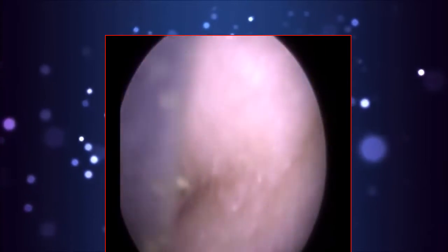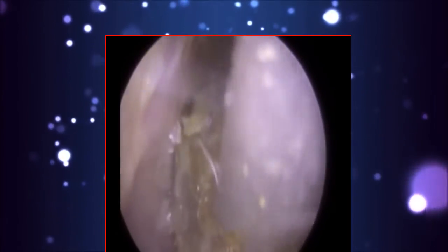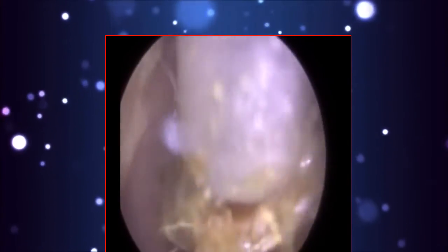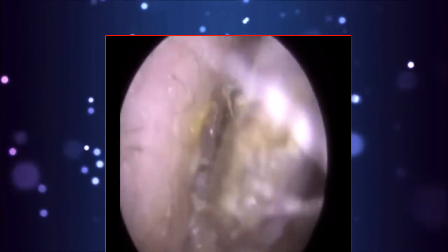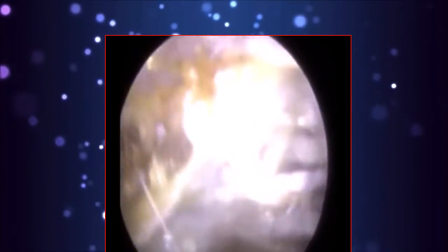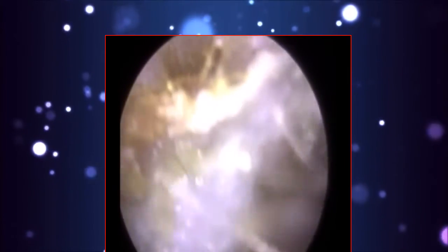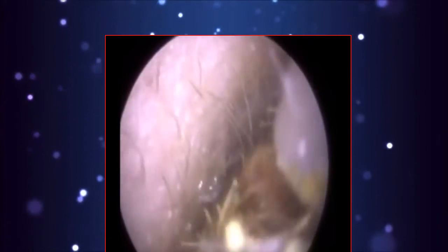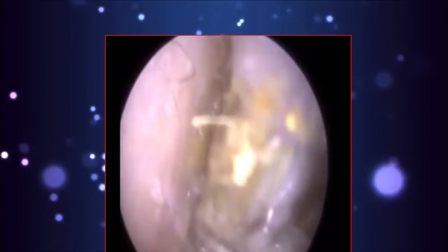So yeah, the eardrum's nice, visible, healthy. This is the patient's, same patient, but just the right ear. You can see a plug of wax here. It's not as impacted as the left side, so the patient did attend, he wasn't aware that his right ear was even blocked, given his left ear was so bad. So it was only until I removed the left plug of wax, he suddenly noticed that his right ear wasn't as good. So I'm just loosening this.